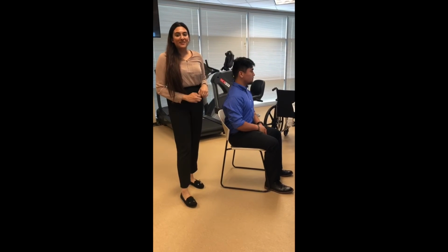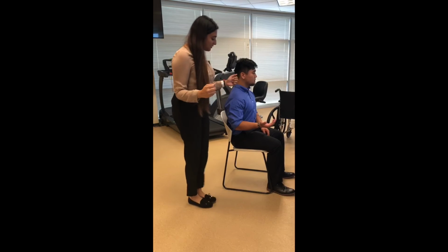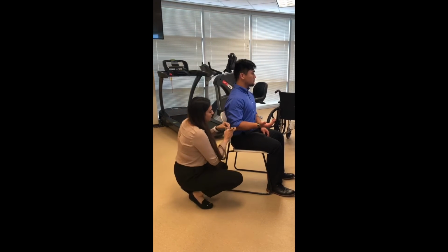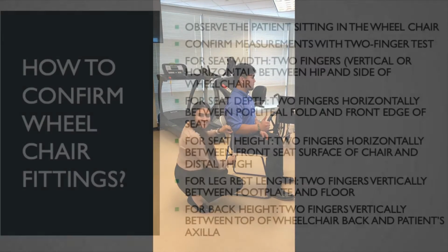Lastly, we're going to measure the armrest length. So we're going to have the patient flex the arms at 90 degrees, keeping the arms close to the trunk, just like that. We're going to measure from the olecranon process down to the seating surface.